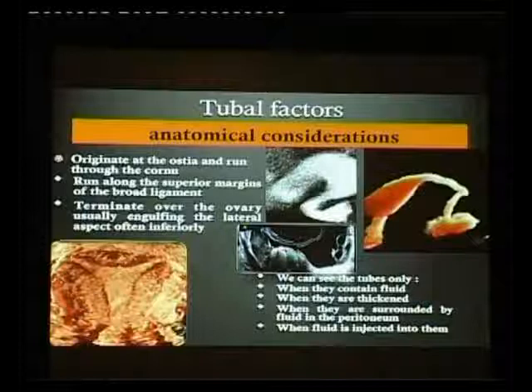So the embryo transfer day is not day 2, but we can take a rough idea and then triage the patients by endometrial flow index. We know the flow index on the embryo transfer day, but that is not part of day 2, so I'll skip this. And then we need to identify Asherman's disease. Even on day 2, there could be an incidental finding of Asherman's in that patient.